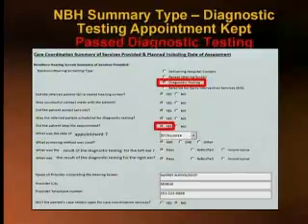You've talked with the hearing provider and you found out that they did the ABR, the AABR, and the child passed in both the right and the left ear. Because remember, for all repeat hearing screen diagnostic testing, we've got to have results for both ears. Then we passed in both ears, and then I'm putting my audiologist information there as well, and the contact information.